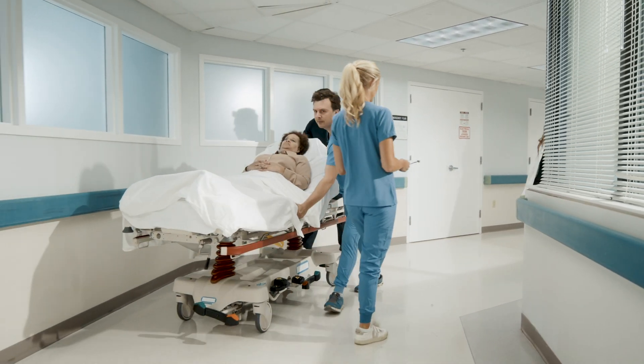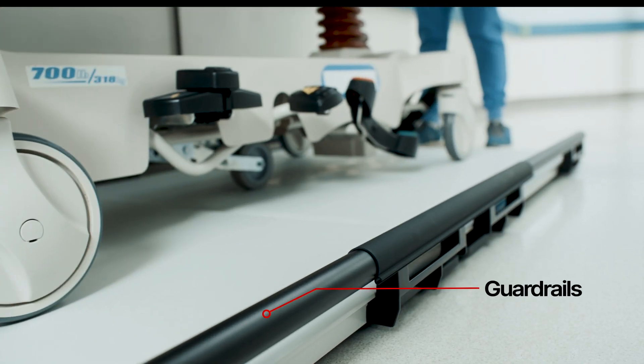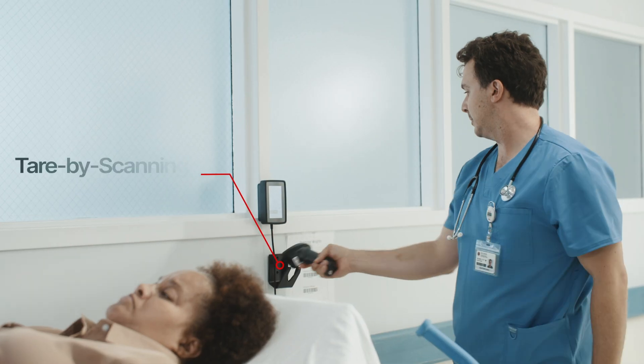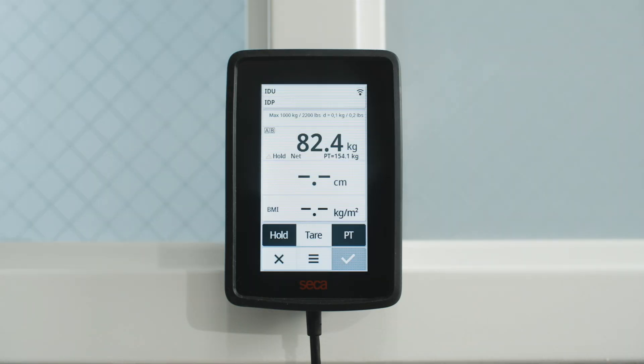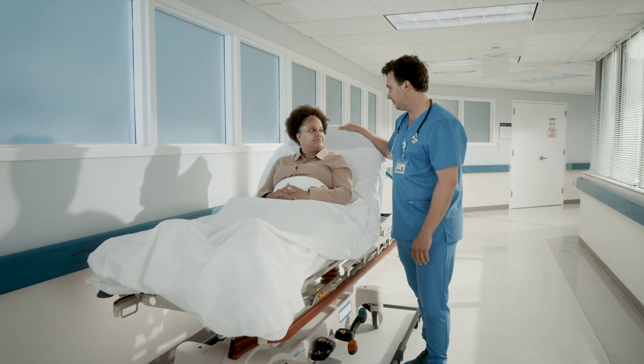When time is of the essence, getting accurate weight measurements can't slow you down. The X-Line Stretch allows you to quickly acquire the weight of an incoming patient. The scale can swiftly remove the weight of the stretcher, leaving you with the accurate weight of the patient. No more relying on verbal weights or estimations.